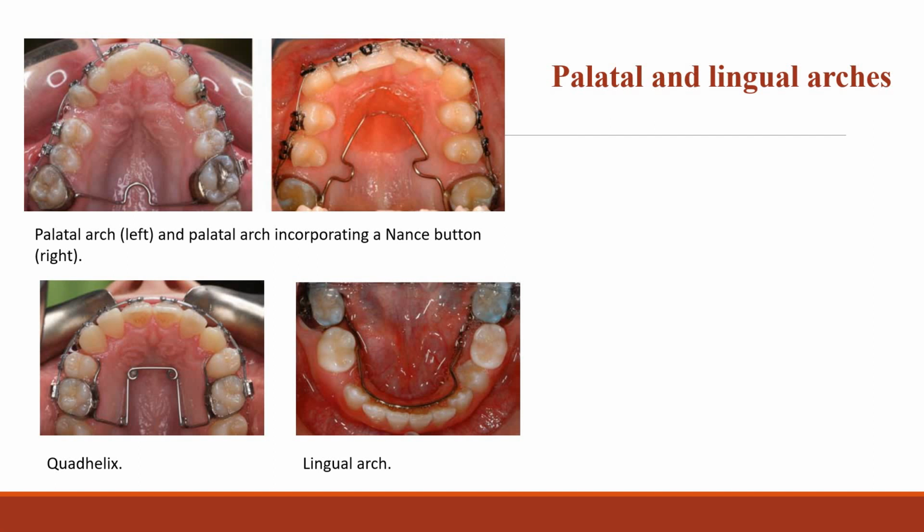which lies on the palatal mucosa. This also acts to fix the upper arch length and can be used for anchorage support. However, these auxiliaries can cause soft tissue irritation if the acrylic button embeds into the palatal mucosa, especially if left in the mouth during overjet reduction.